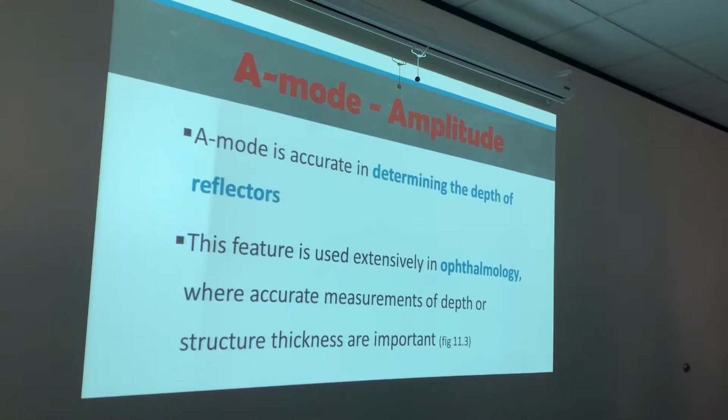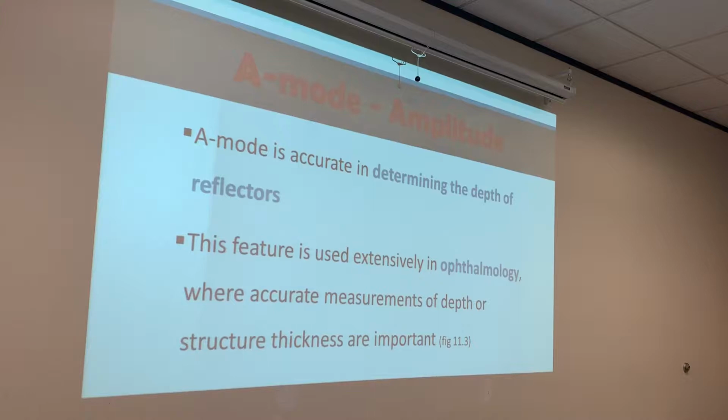Okay, you have an image right there, guys. Image 11.3, and that's an actual image of an eyeball. Everybody see that? Okay. Right at the transducer, you see where it's big and black. That's going to represent the actual pupil. I just want to say eye, because the eye has an iris and different parts, cones and rods, cornea, all of that stuff.